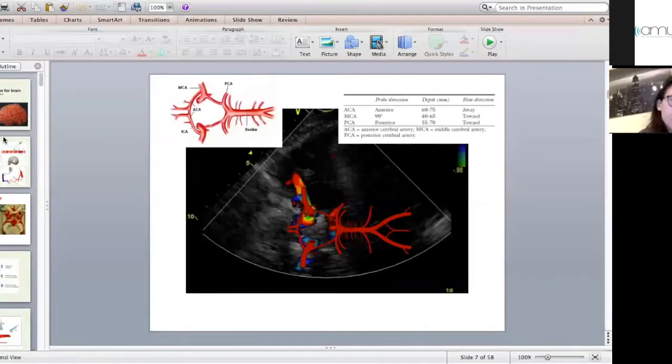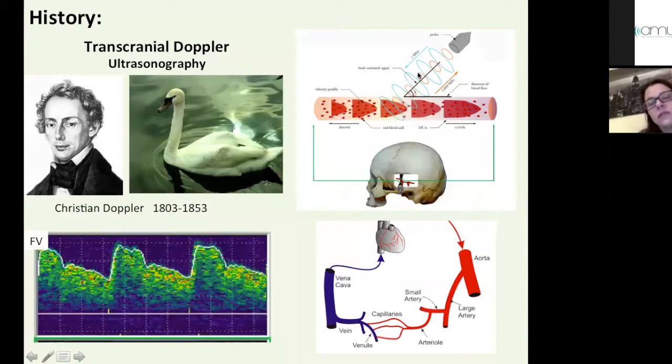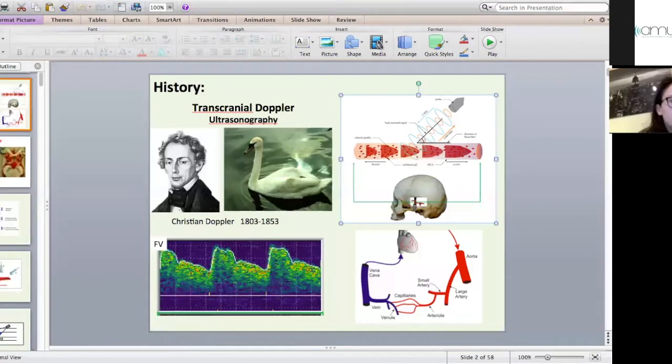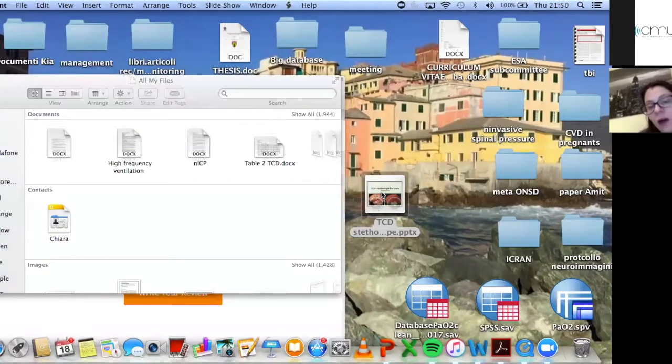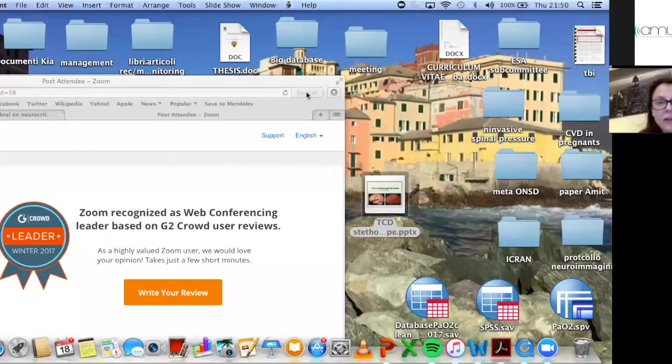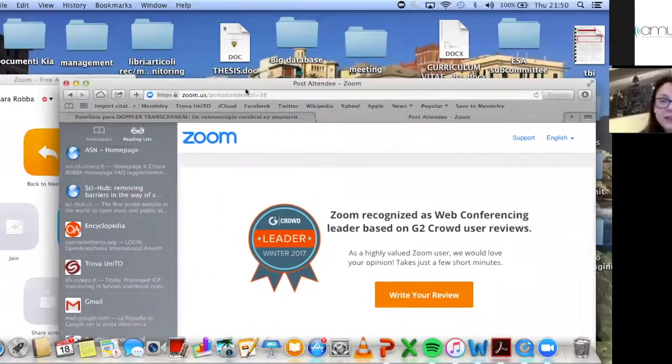But traditionally, well, now things have changed, but this is a nice example, there was the blind transcranial Doppler. This was just a 2 megahertz probe, but it was not an echo duplex ultrasound, so you are not actually able to see the brain anatomy. You are not able to see the vessels, but with the M mode, you are able to insonate the vessels, and according to the different characteristics of the vessels, you are able to differentiate them, okay? I think this is how I learned, okay, because I'm old, but nowadays what I would suggest is to use the ultrasound because it's much easier and it gives you less chance of mistake, okay?